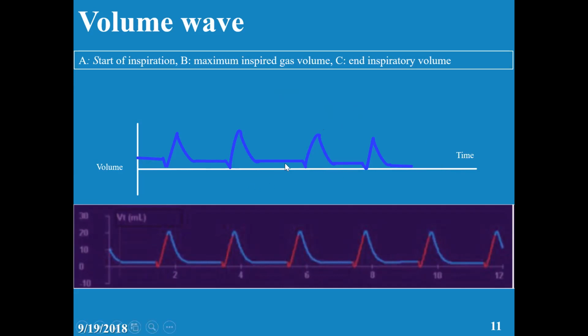Now, if you look here, you can see this notch. You see this notch? You guys see this notch? You can see it here also. Yes, this is a trigger. So all these breaths are assisted, because they are contributed by the machine. But you can see here there is a trigger.